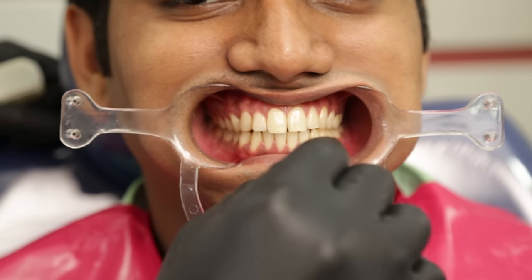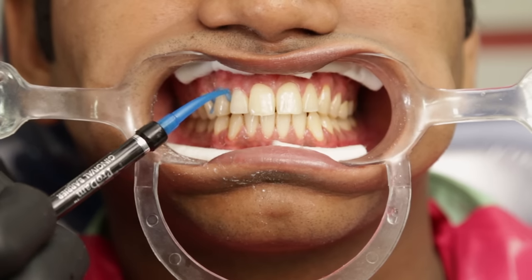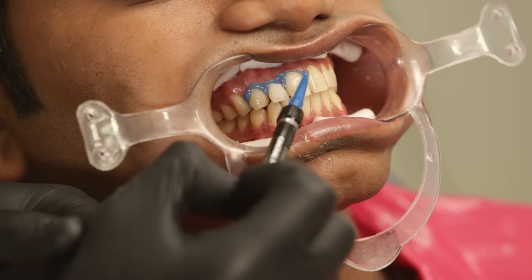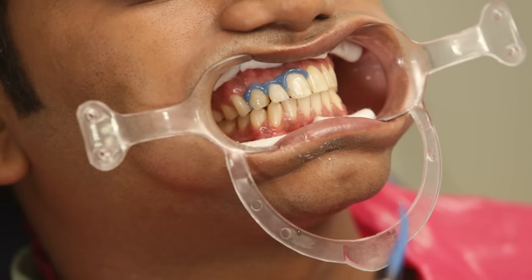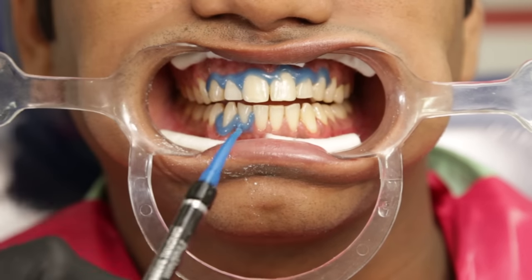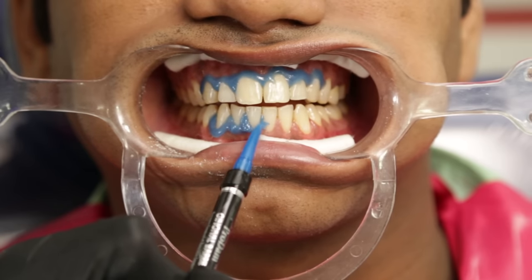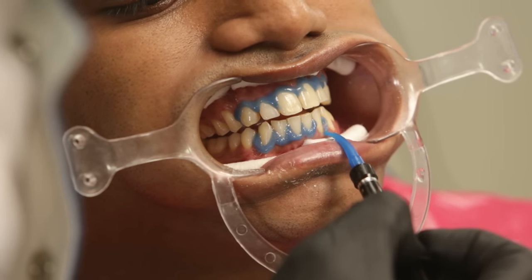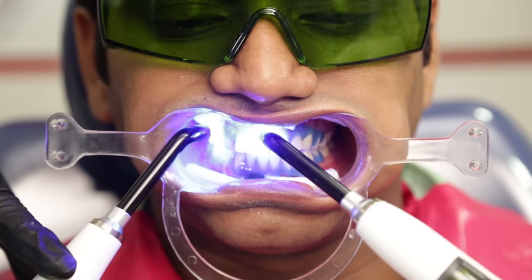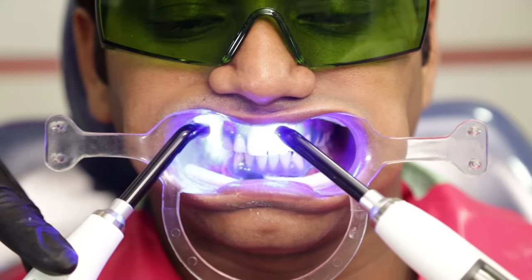I will apply some Vaseline onto the lips before I start the process. The teeth are then rinsed and dried, followed by the application of the gingival dam. The gingival dam or the barrier, as we call it, prevents the bleach from contacting the gums. I therefore like to be very generous in applying the dam. We apply a continuous layer of the gingival barrier over the tissues, slightly overlapping the tooth cervically and also covering the interdental papilla. It is important to evaluate that there are no gaps at this stage, following which the dam is light cured.